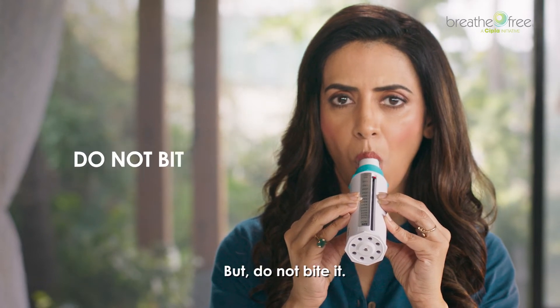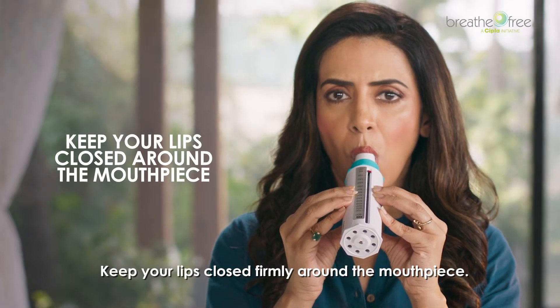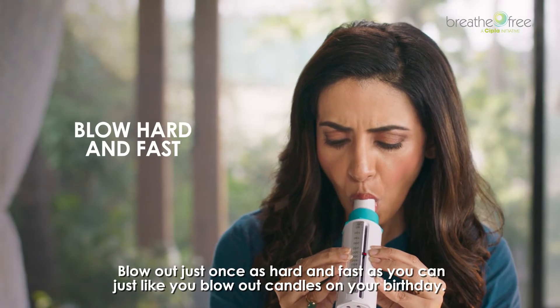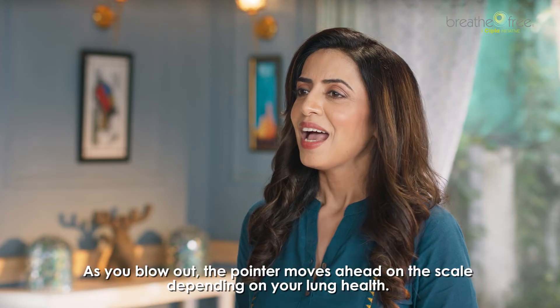Then place the mouthpiece of the breathometer in your mouth between the teeth, but do not bite it. Keep your lips closed firmly around the mouthpiece. Blow out just once, as hard and as fast as you can — just like you blow out candles on your birthday.